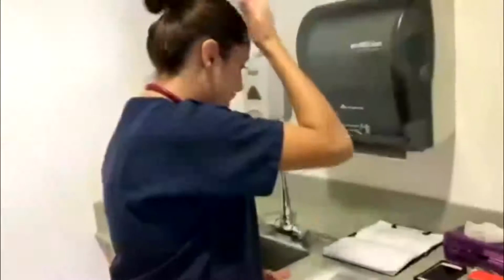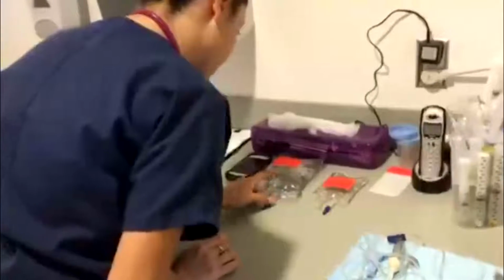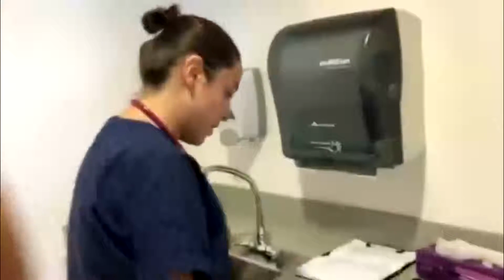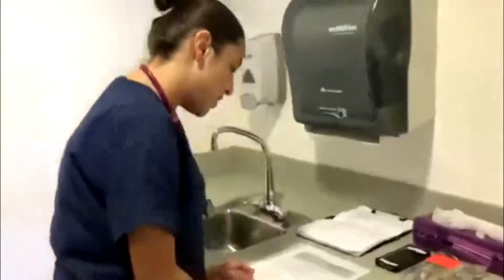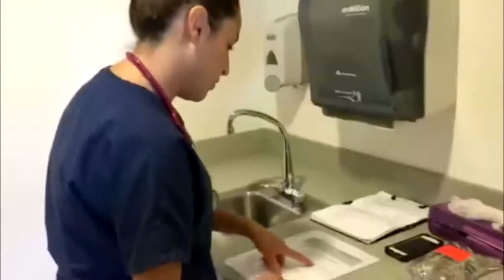Okay, so at this point, I also want to check the expiration date on both bags. So right here, it says the expiration date is September of 2020 and September of 2020, so they are both still current and not out of date. Now I want to write my calculations, which I already did. So for Zosyn, I'll be administering 3.375 grams in 100 milliliters of sodium chloride.